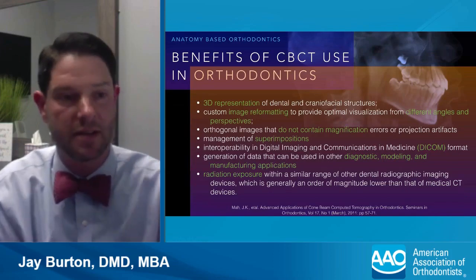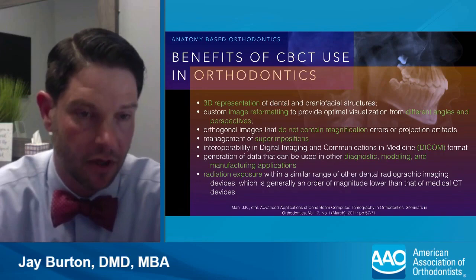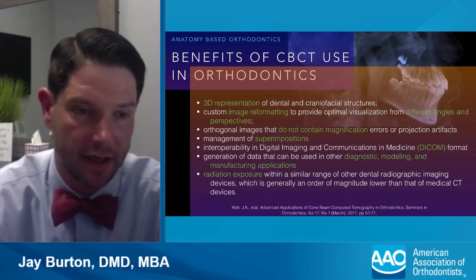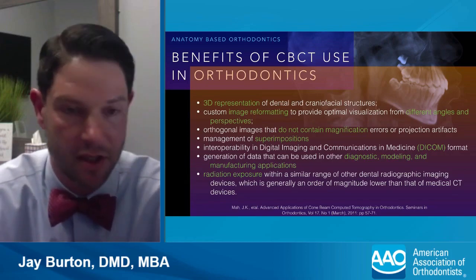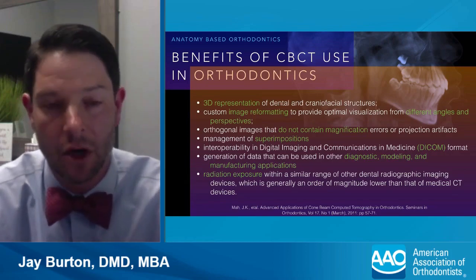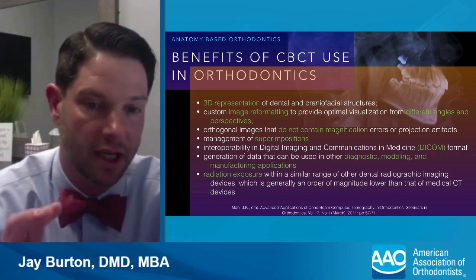So what are the benefits of 3D, of CBCT in orthodontics? This is from an article by Ma, and ultimately it's the 3D representation. It's the ability to reformat the image into different perspectives. No magnification error. You can look at superimpositions, which we'll talk about shortly.